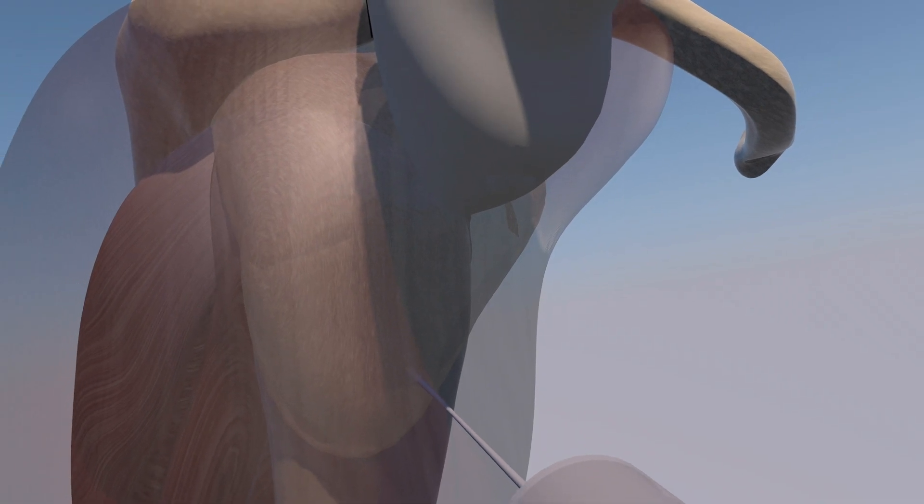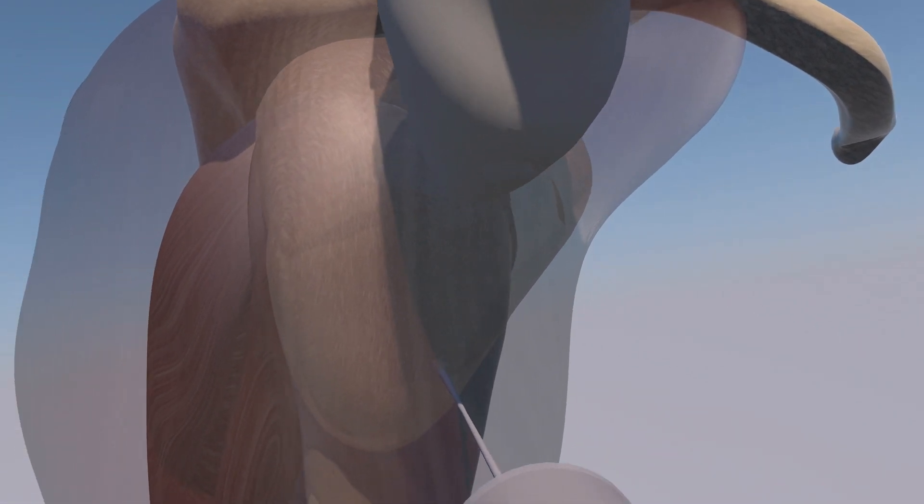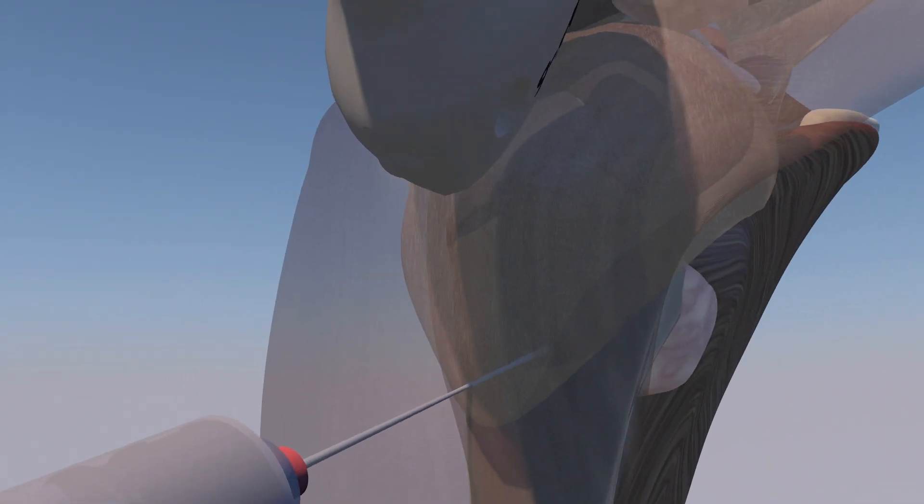Here we're just rotating our view to get a different perspective of exactly where the needle is. Now we're rotating to an anterior perspective, and again we can see the needle within the subdeltoid bursa.